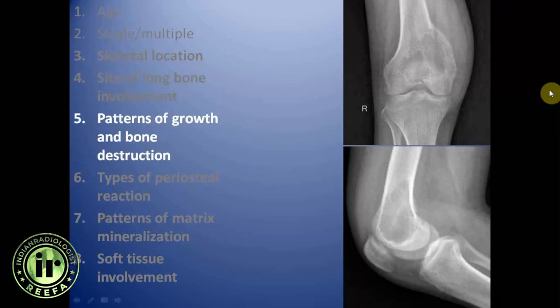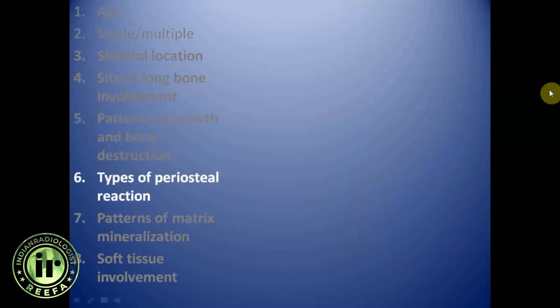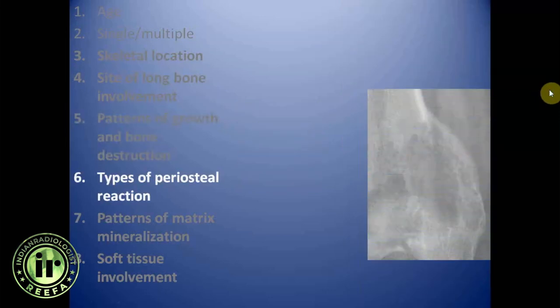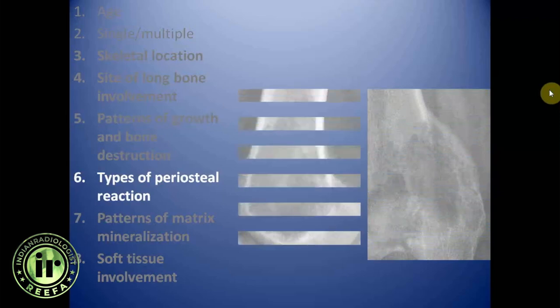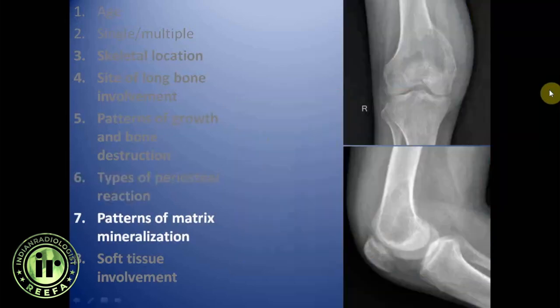The pattern of growth and bone destruction is geographic to moth-eaten with a narrow zone of transition. The type of periosteal reaction shows mild periosteal buttressing and is predominantly non-aggressive. There is no obvious chondroid or osseous matrix mineralization in the tumor.